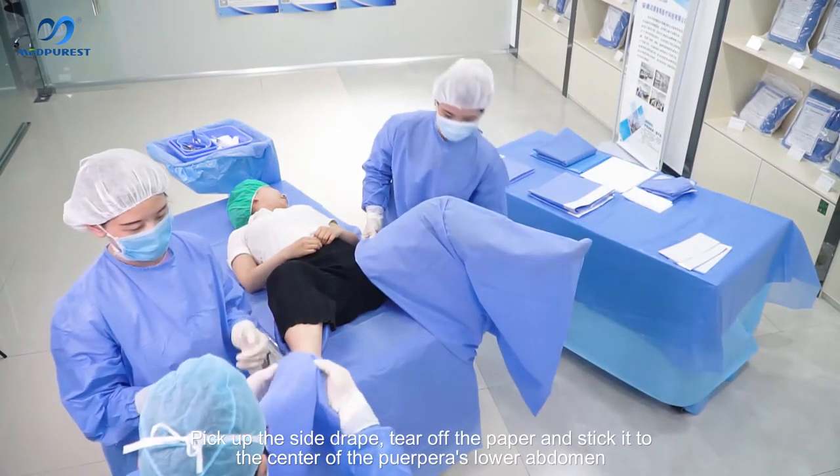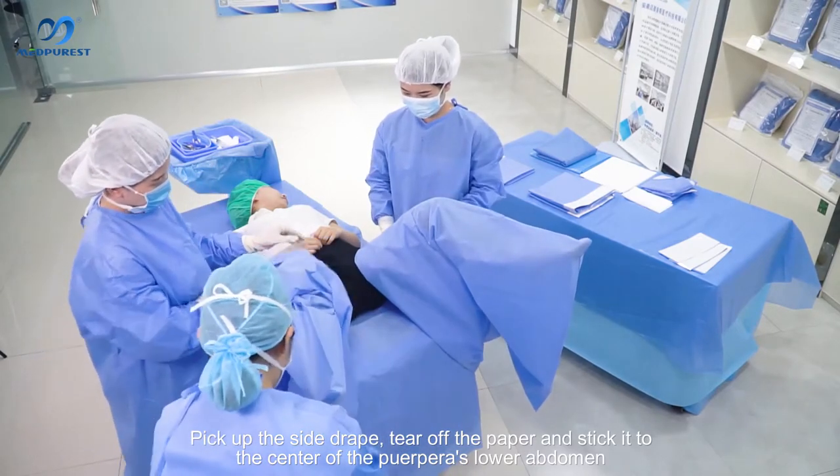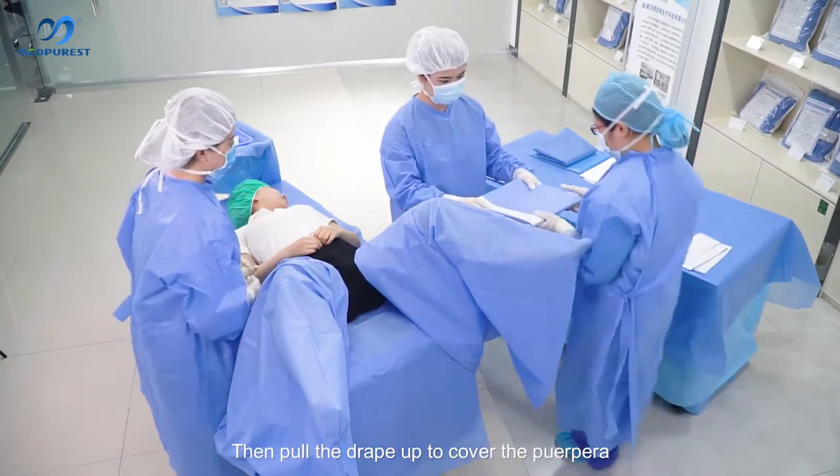Pick up the side drape, tear off the paper, and stick it to the center of the patient's lower abdomen. Then pull the drape up to cover the patient.